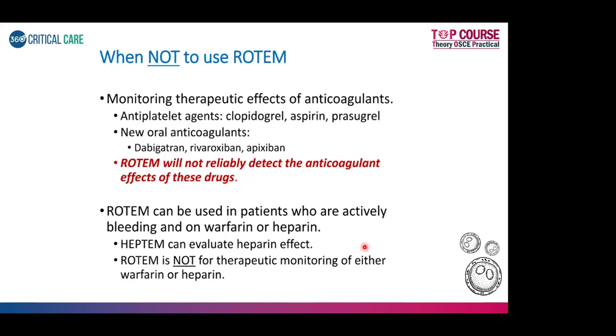So what are the drawbacks of viscoelastic testing? Earlier, someone told about platelet function. Can we test the functionality of platelets with viscoelastic testing, if the patient is on aspirin? No, sir. What do you use for that? Sonoclot, platelet aggregometry. Okay, all of those tests have to be done. Not required, but if they ask you, that is one of the drawbacks.